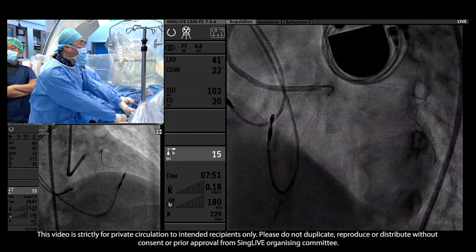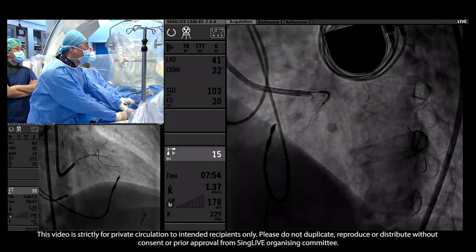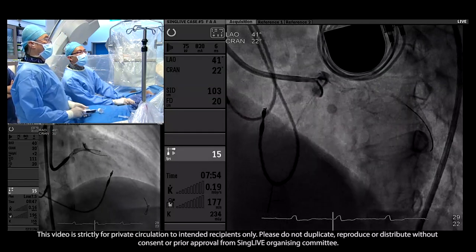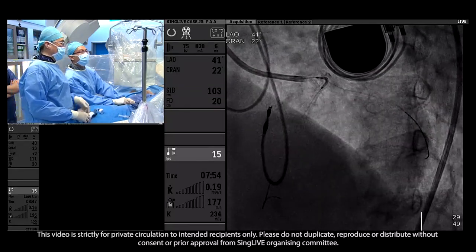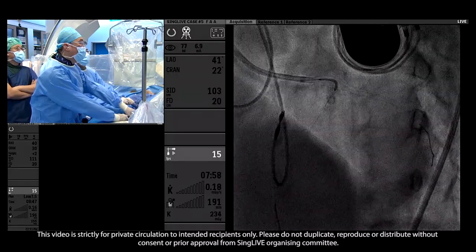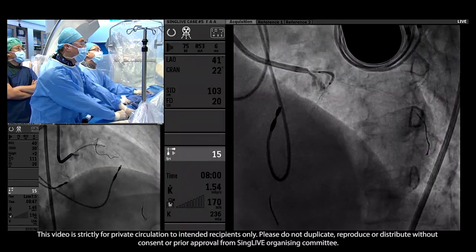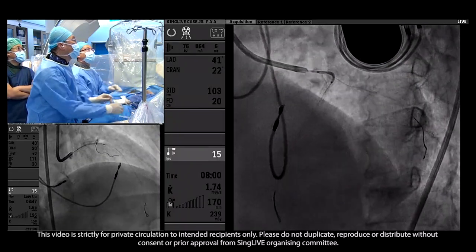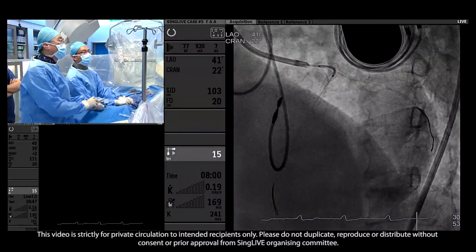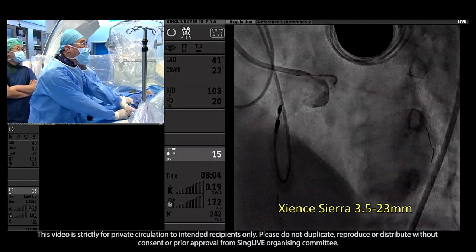Sometimes this hematoma actually can travel. So it may go to the circumflex. I mean, LAD has a stent there, so it may not go to LAD, but I have a case where the hematoma actually traveled from the LAD to left main to the circumflex. So I have to be mindful. Yeah, it's good. Looks pretty good. Overlap, okay. Deflating. Go ahead.